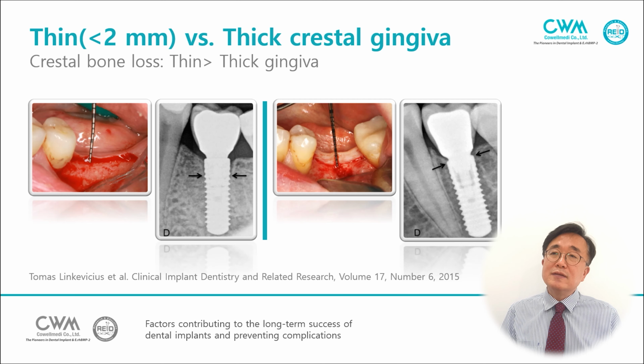But with thick biotype gingiva, there is no bone loss because the biological width is already maintained.